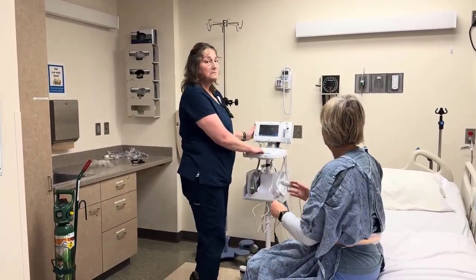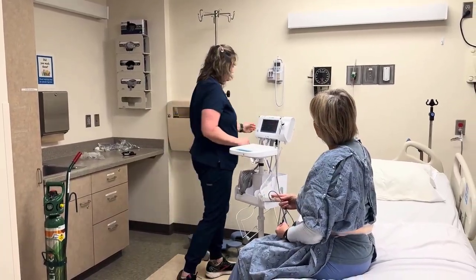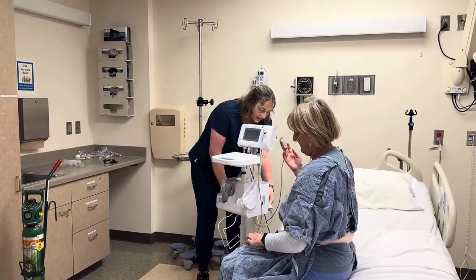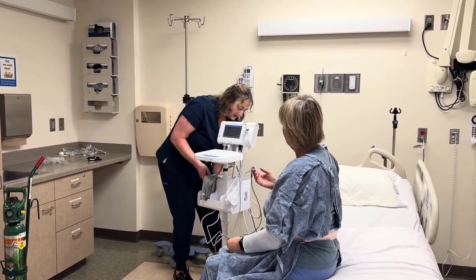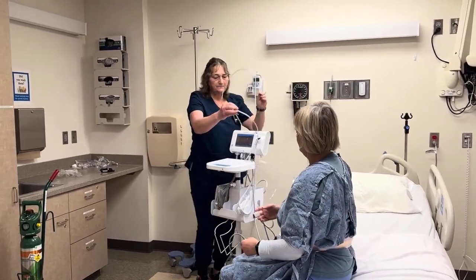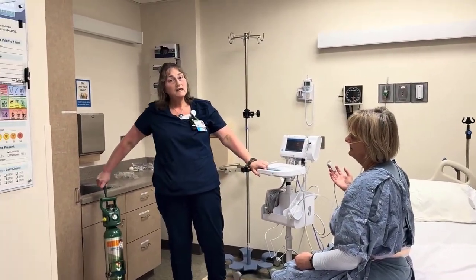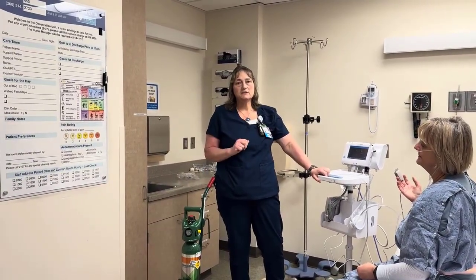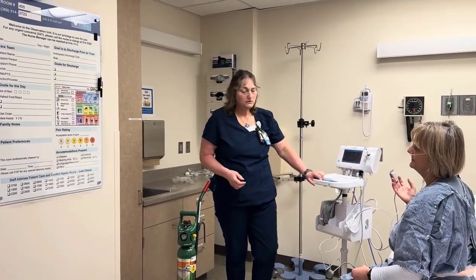Okay, so again, I'm going to monitor her SATs very closely. I'm going to pull her off the wall oxygen. I'm going to unplug this so we can take this with us. Her stats are still in the 90s because she's on oxygen. So I'm going to turn this off, unplug this, and I need to have an oxygen tank with me so that during the walk or the exercise, if she falls below 88%, I can get her back on oxygen so she doesn't go into any kind of respiratory distress.